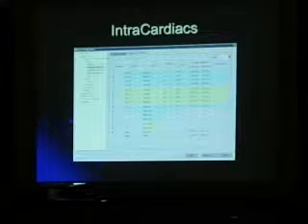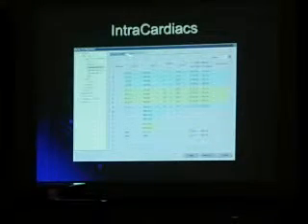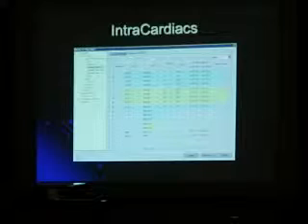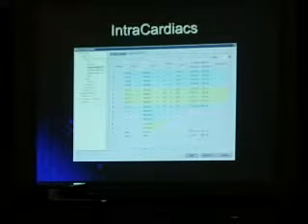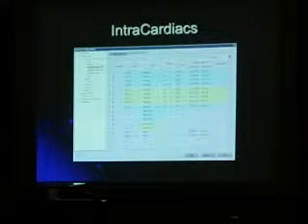Our intracardiac settings are a little different. We have the opportunity to change the label and set the type. See how it says bipole, and these are the inputs, and they're placed on each of those blocks. There are 32 pinpoints to plug into those blocks, and we just plug them in. You can plug them in any way you want, but remember, you've got to make it make sense so whoever's troubleshooting behind you can figure it out.